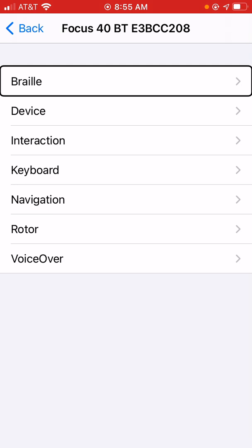Now, what we're presented with is a list of categories — categories of commands. So, we can customize commands for Braille manipulation, VoiceOver navigation, manipulating the rotor on the Braille display, etc. What I'm going to do here, just for the sake of this demonstration, is go to the Braille category and assign a command for decreasing the auto-advance speed. Auto-advance is a feature that allows you to read on the Braille display and it will pan automatically after a certain time interval without you having to hit the panning buttons.